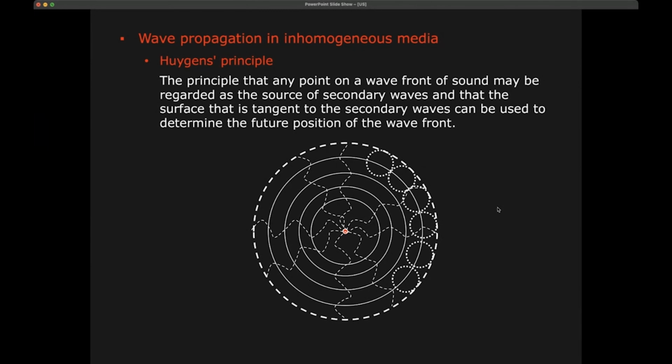So we know that an ultrasound wave that we inject into a medium, or that we can put in contact with a medium, will propagate in that medium. While propagating, it will decrease its amplitude because of attenuation, like exponential attenuation, because of the viscous heat generation, and it will change its frequency content because of the nonlinearity of the propagation. So these are already two effects that happen when we travel through a homogeneous medium.